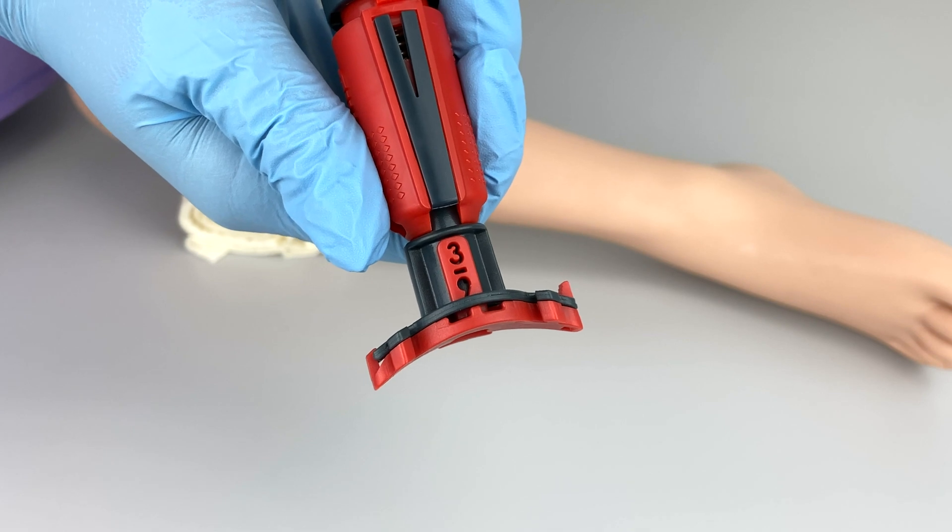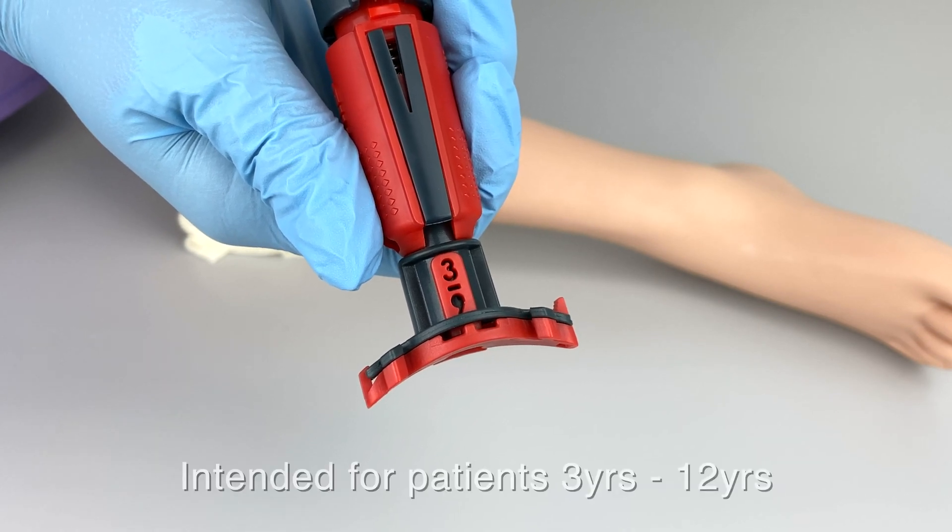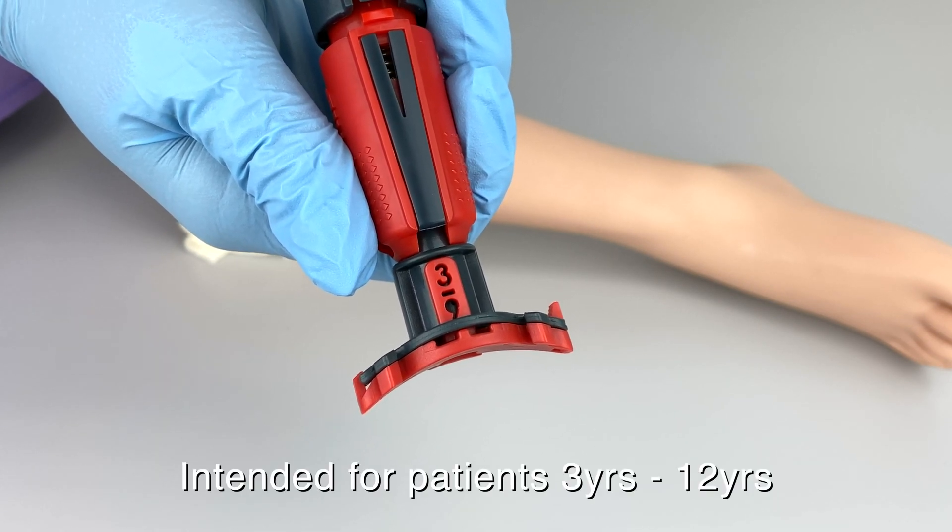The NIO Pediatric Intraosseous Device is intended for patients ages 3 to 12 years of age.